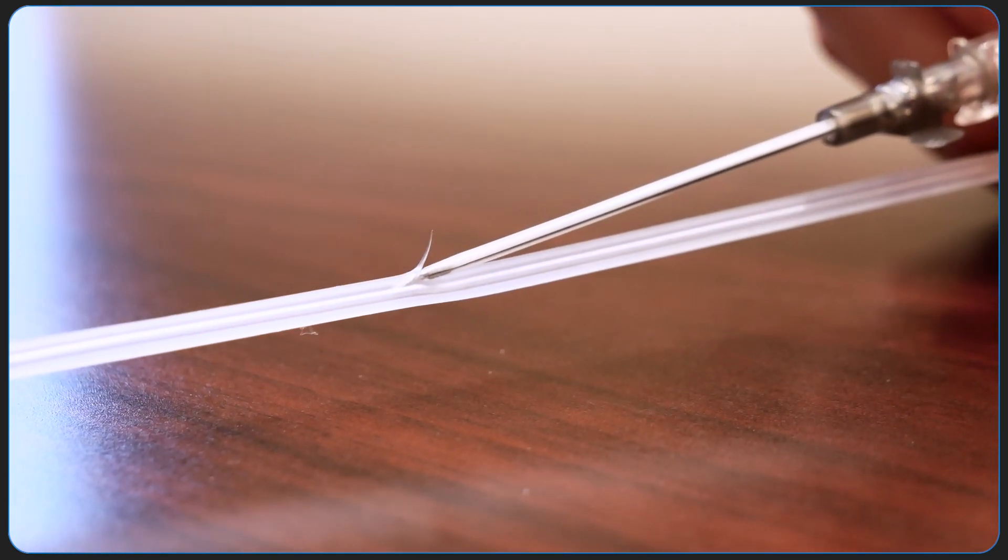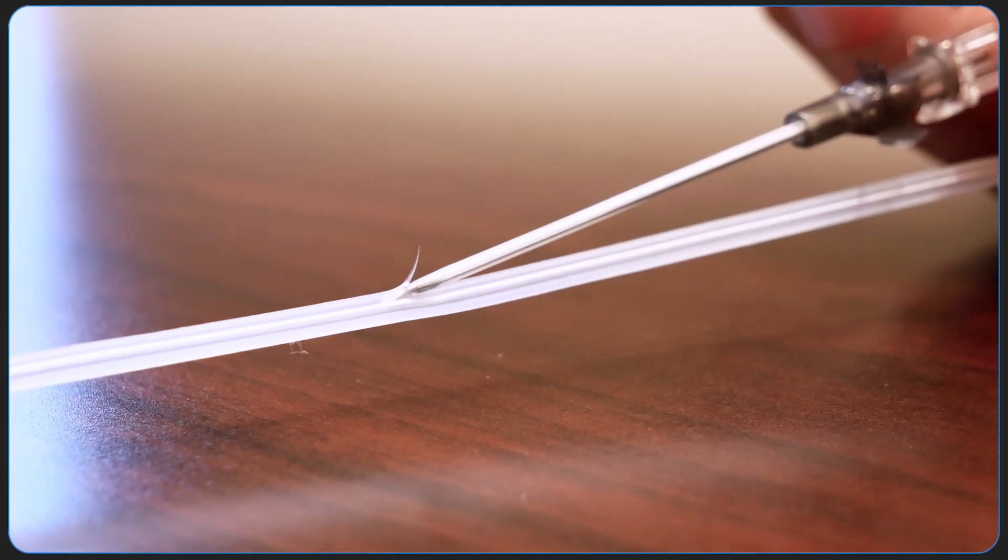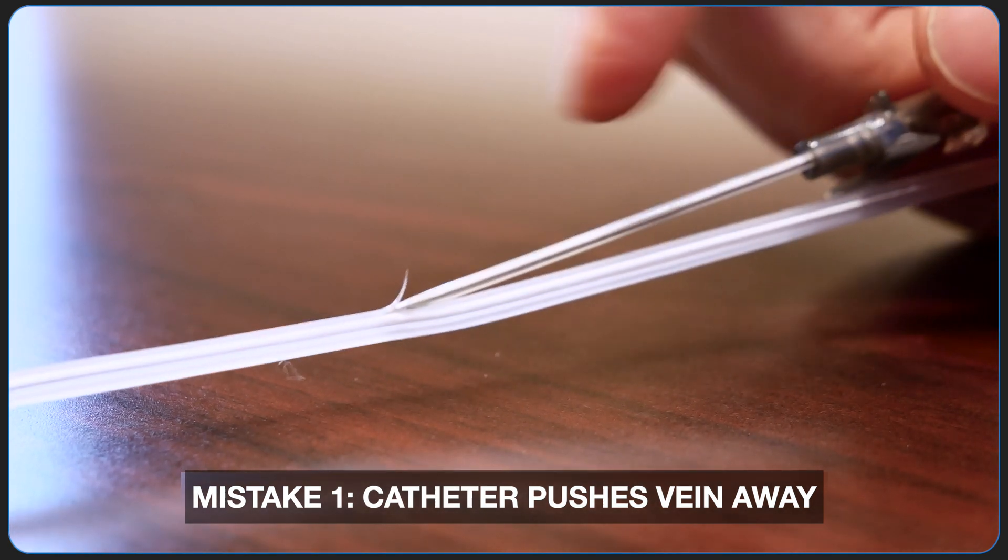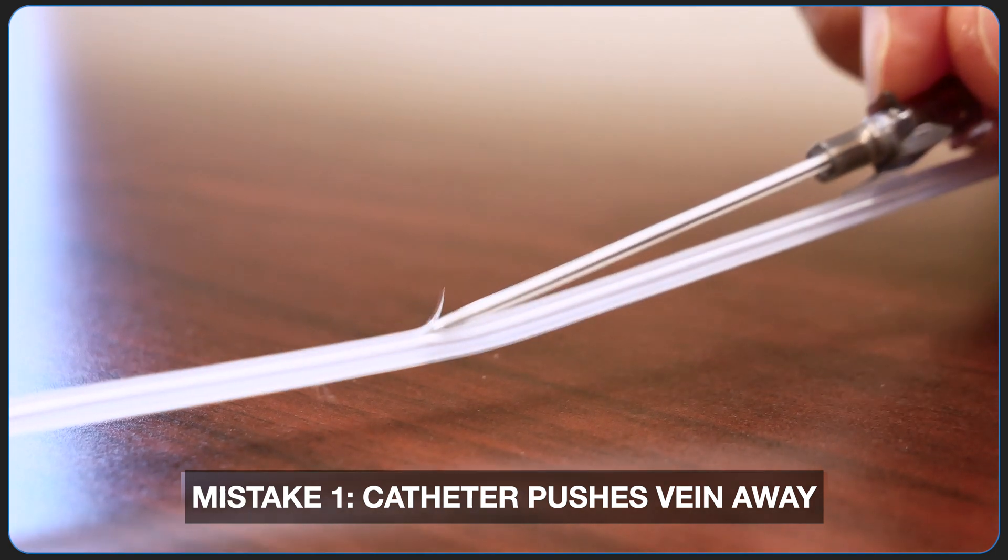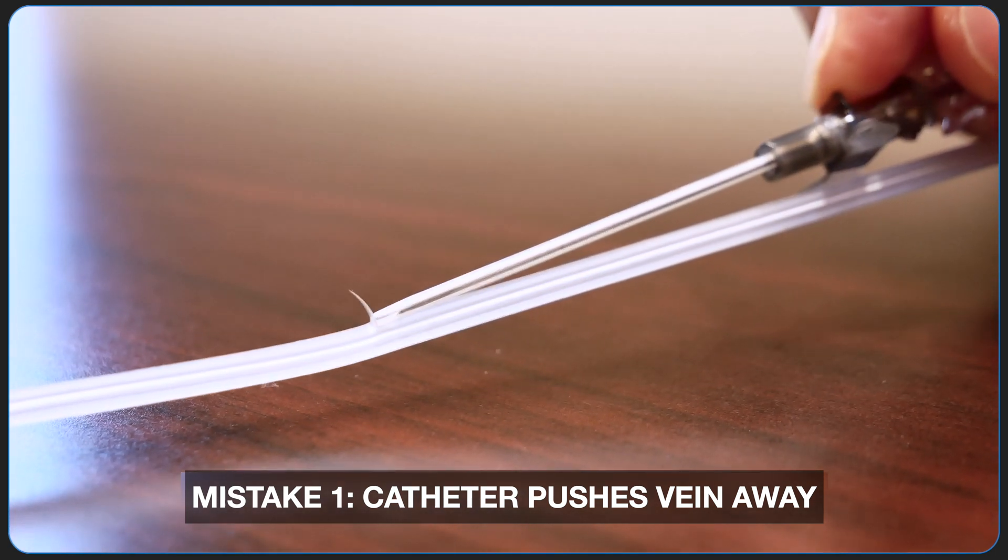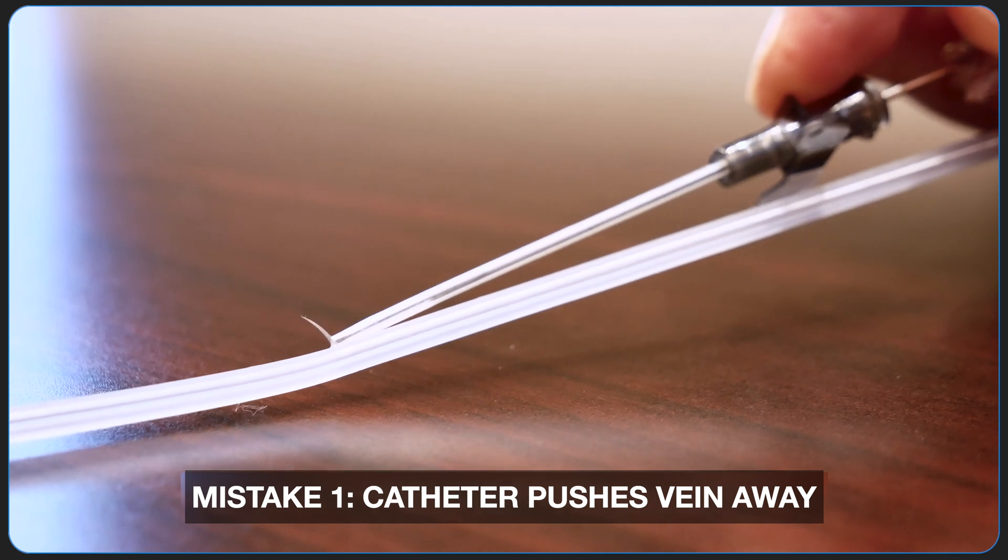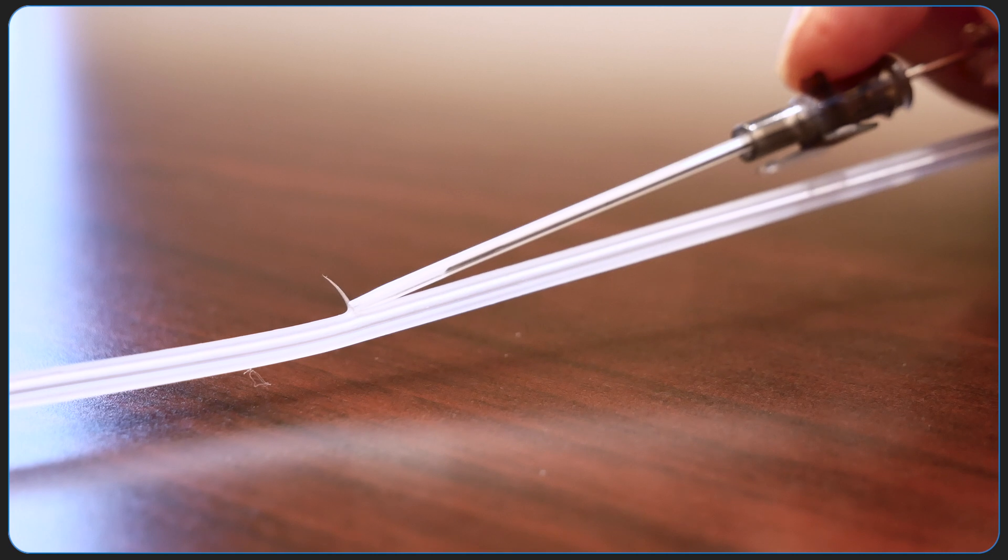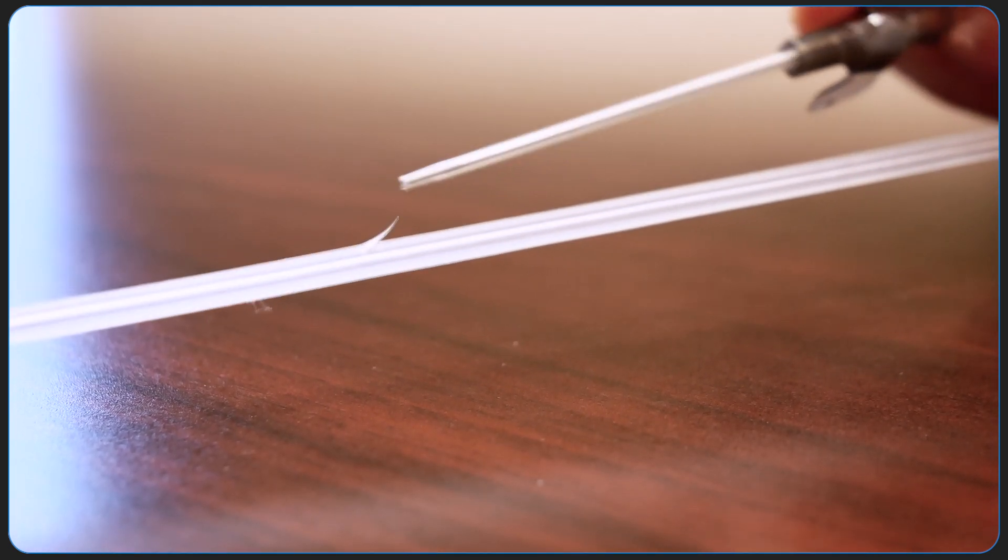So you nudge in to get your flash and now here's where people make one of two mistakes. Either they try to push the catheter off the needle now but because the bevel is not entirely in the vein if you try to do that you're just going to push it away. Your needle's coming out, your catheter is not advancing into the vein. This is going to be a blown IV. So that's mistake one.